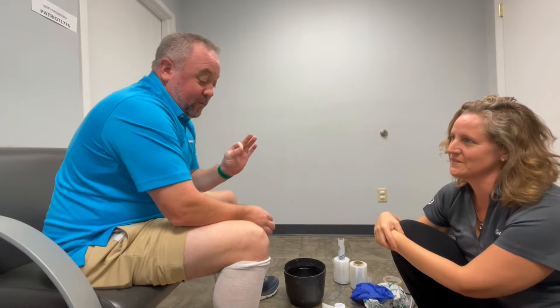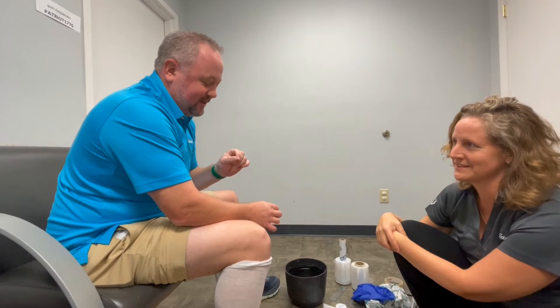This is Sam Hale and Jenny Nance from Philhour Europe and from Philhour America. Today we're going to show you how to take a cast for the custom dynamic walk. We want to help everybody be successful because we run into a lot of casts that we really can't use, which makes it more expensive for you and us.